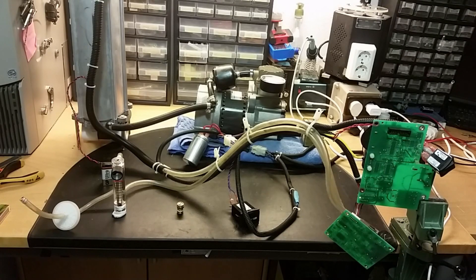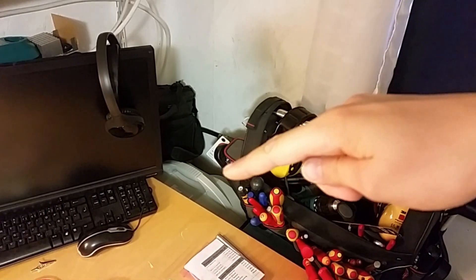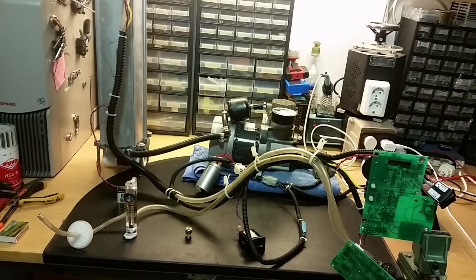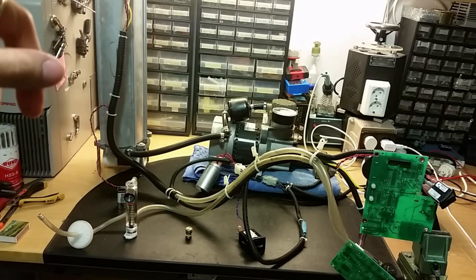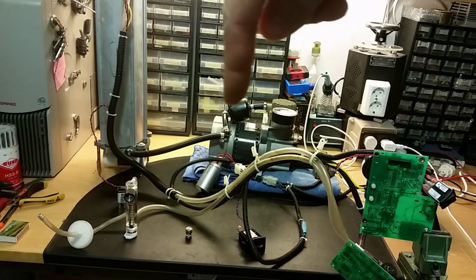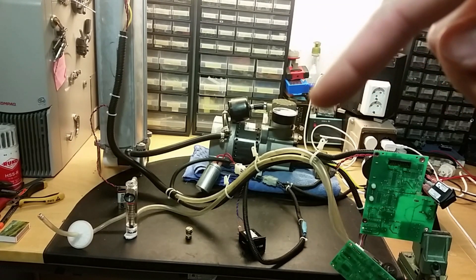Let's go to part two of this video — the teardown of the oxygen concentrator. I had two oxygen concentrators. The one I made a video of in part one is right there, and this is the other one I got. This is totally stripped down; all plastic casing is removed. Here we got the sieve bed, the compressor with a dryer filter, and I hacked on a pressure gauge so we can have a look at the pressure.